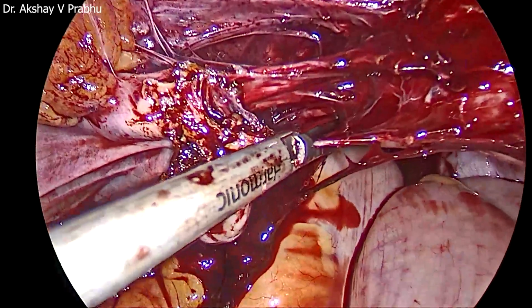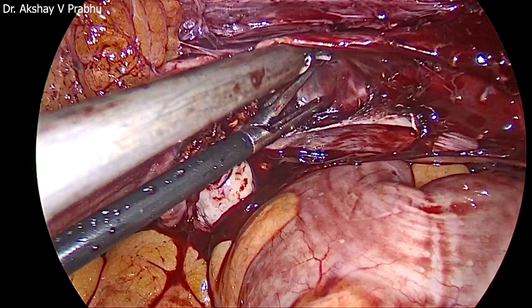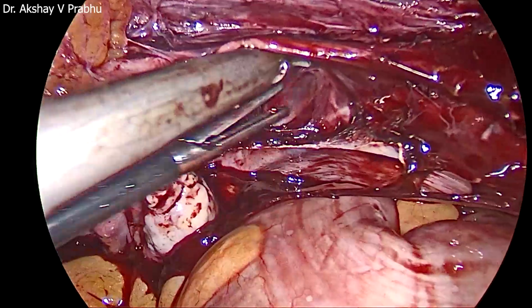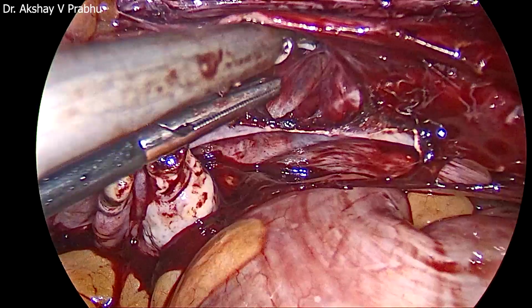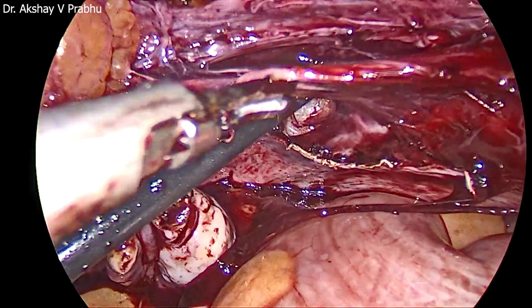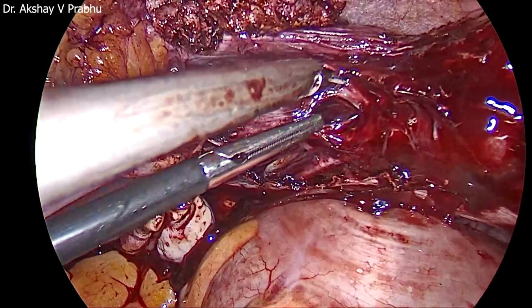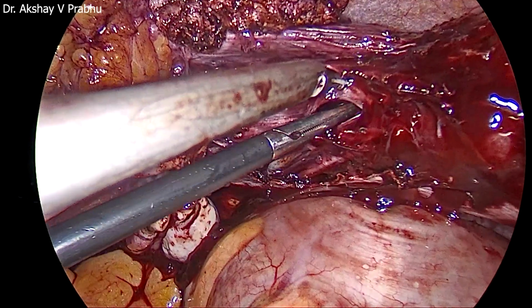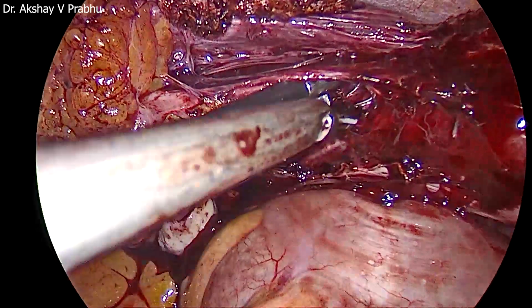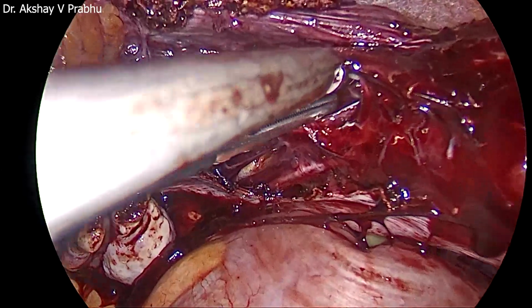That is more towards the uterosacral, where I am cutting now. And again trying to find a virgin plane. Once this is localized, I can cut the tissue band above it. So that is a fresh plane. I've realized that this is a tissue band and I can just cut it off. So blunt and sharp dissection. It's a combination of blunt and sharp dissection always.